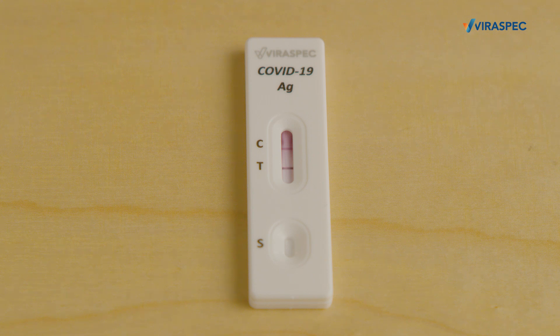However, if there are two lines — one next to the C and one by the T — you have tested positive. This means that you have COVID-19 and that you should follow the guidelines from local health authorities. If you only get a T but no line at C, the test is invalid and you must repeat it.